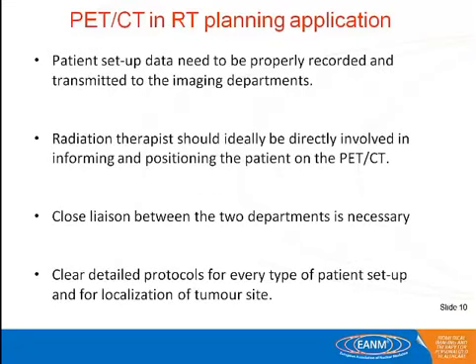We need to record setup data. So our radiotherapy people say, okay, we plan it this way, and they have to record really accurately. And the ideal situation is having radiation therapists involved in the patient imaging capacity.